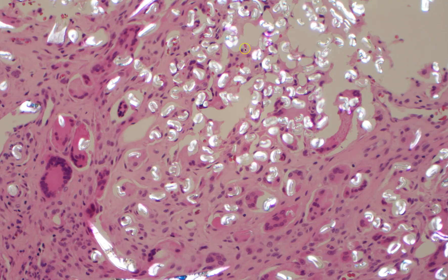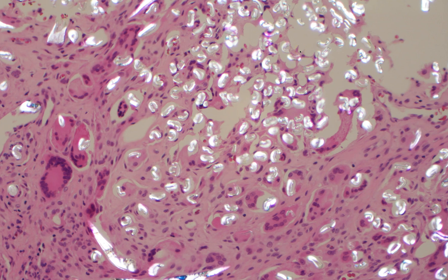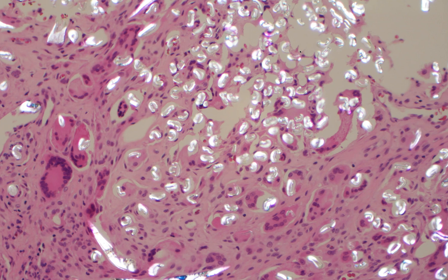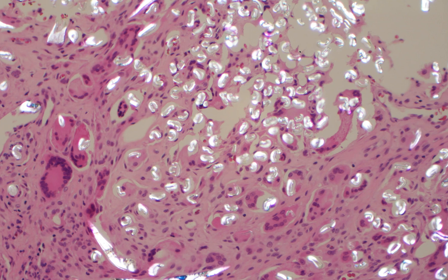Here's another look. This material, if it is cotton, often stains with GMS — Grocott Methenamine Silver. If you're having a bad day, you could maybe get this confused with fungus. Once you've seen fungus you know I'm not aware of any fungus infecting humans that has this kind of look. But if you had a tiny fragment and saw it in a giant cell, thought of infection, and did a GMS or PAS stain, sometimes these things can light up on those special stains and cause confusion with fungus when, in fact, it's foreign material.